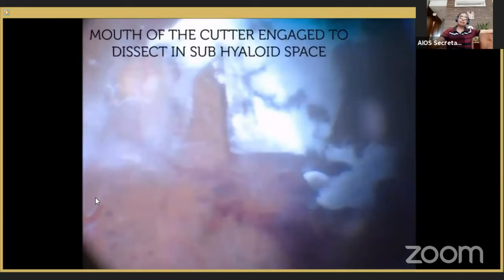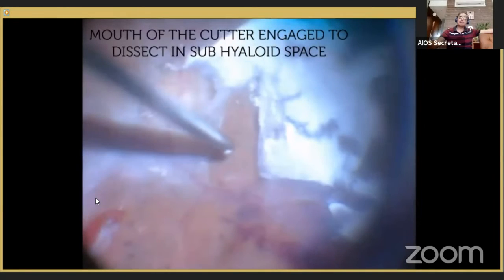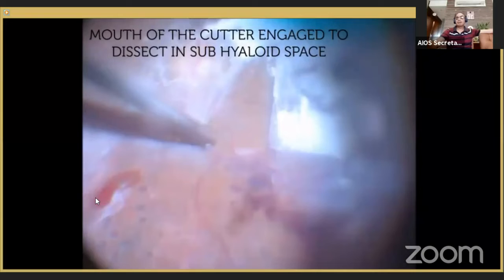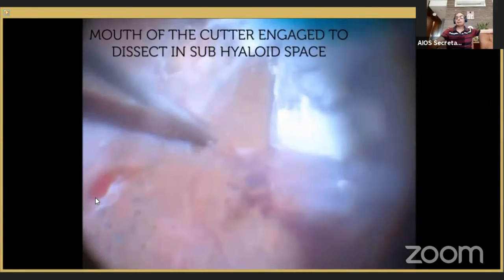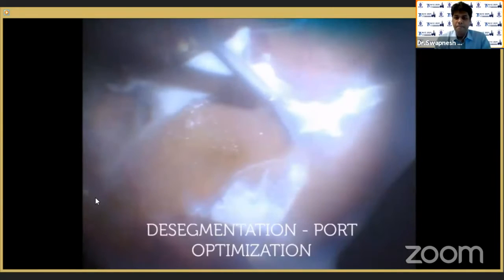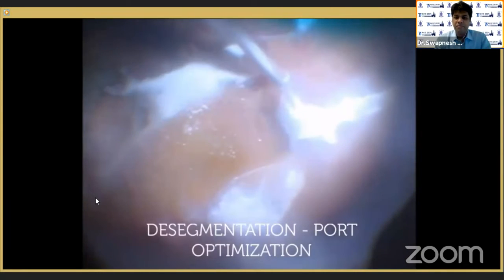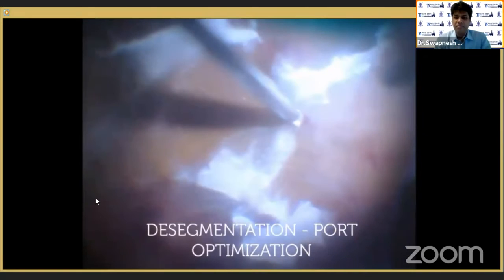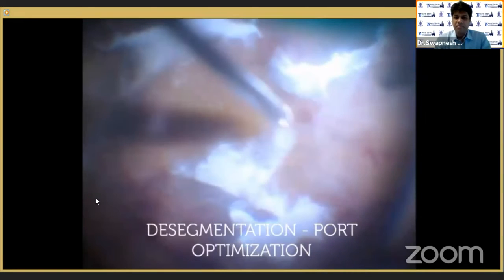We have to be extremely careful and ensure that we are not traumatizing the retina below. With port optimization, we can go into the cleavage plane and start the dissection. We have to be careful not to traumatize the retina below these membranes. Because of port optimization, the segmentation is quite easy, as you can see.